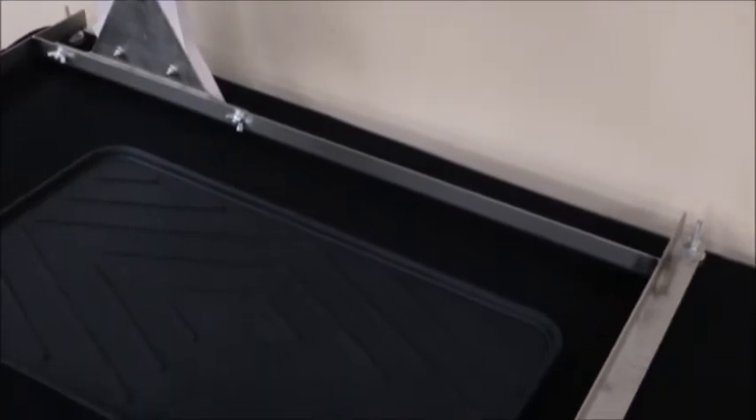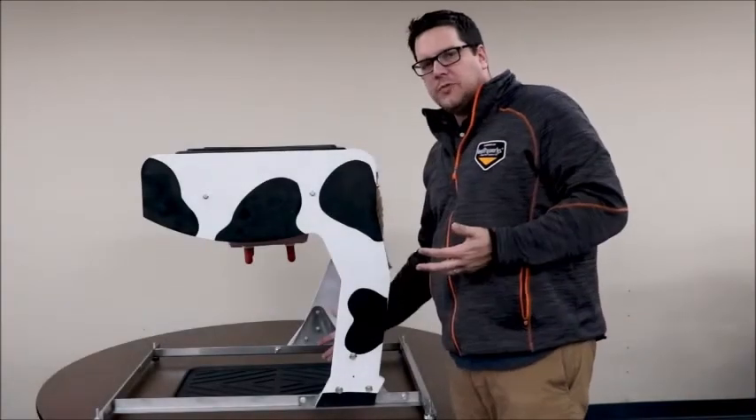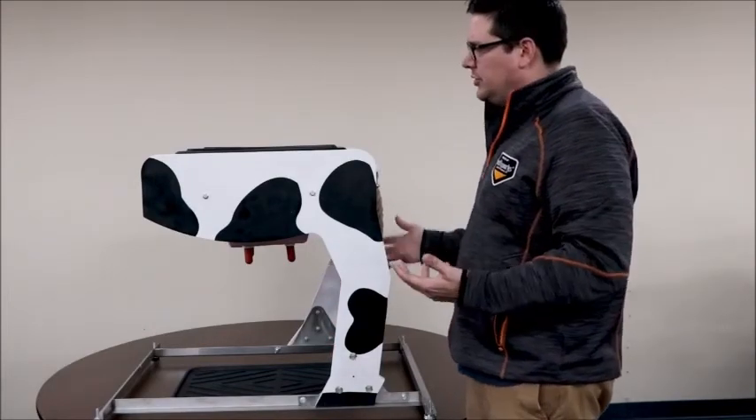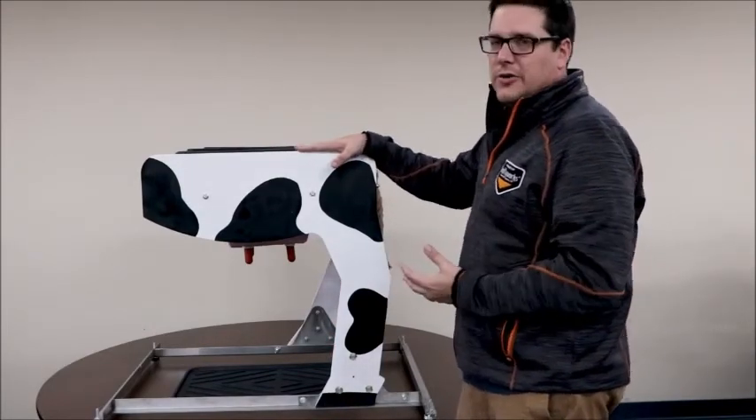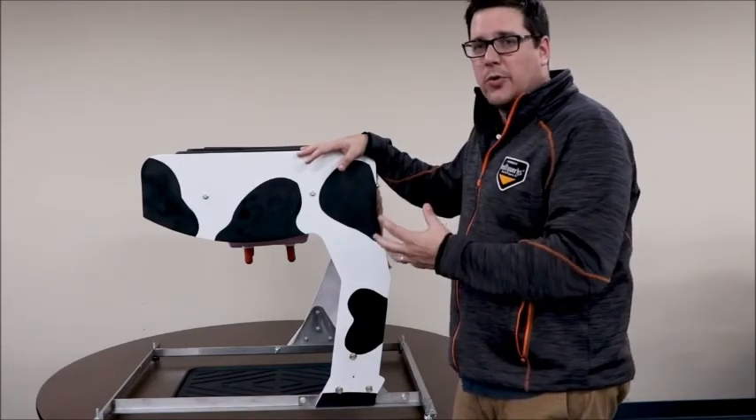We also have a plastic tray here so as you use it, liquid will drip down for easy cleanup and easy usage, allowing your students to really get an understanding of the bovine milking udder and how it all works together.